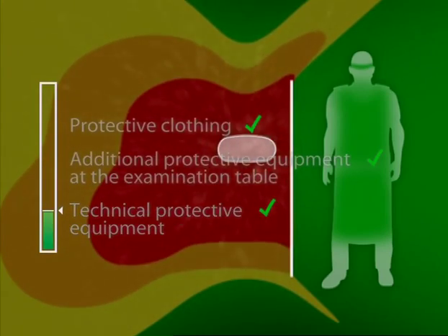Patients and attending medical personnel now receive optimum protection during examinations. Thanks to the implementation of international standards, the introduction of suitable national diagnostic reference values, and the ongoing efforts of system manufacturers, radiation protection is increasing steadily for patients and medical personnel during examinations.